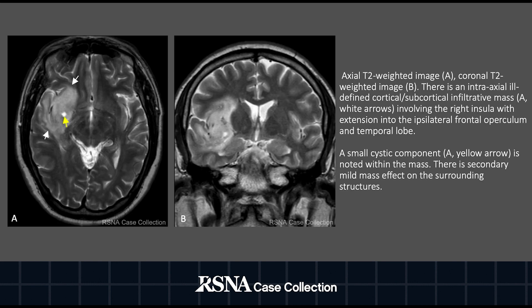An MRI of the brain was performed. This is a T2 sequence in axial plane to your left and coronal plane to your right. There is an intra-axial mass depicted by the arrows on the axial plane involving the right insula, the frontal operculum, and the anterior temporal lobe. The lesion shows ill-defined margins, a small cystic component, and mild mass effect on the surrounding structures, which is better appreciated on the coronal image.